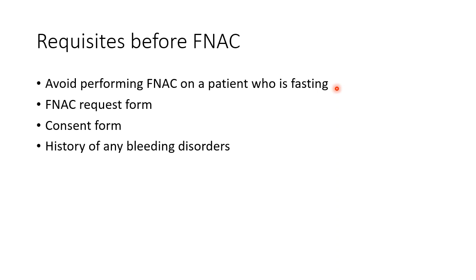Avoid performing FNAC on a patient who is fasting. Ensure that the FNAC request form has been filled thoroughly. The patient's age, details, history, clinical examination, ultrasound findings, and the clinical diagnosis should be mentioned on the request form. Consent form you have to take and take the patient's sign. Explain the procedure to the patient thoroughly. Take any history of any bleeding disorder.